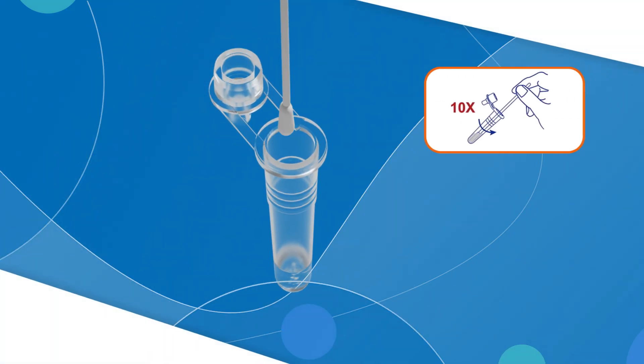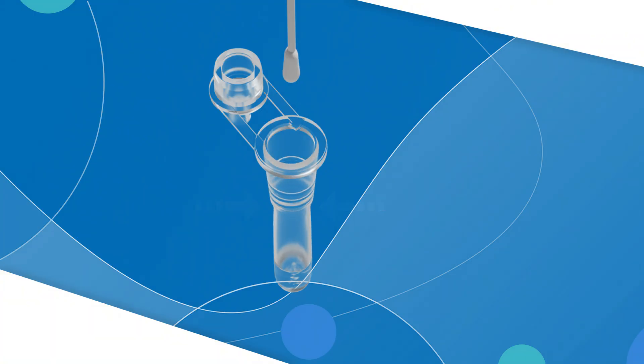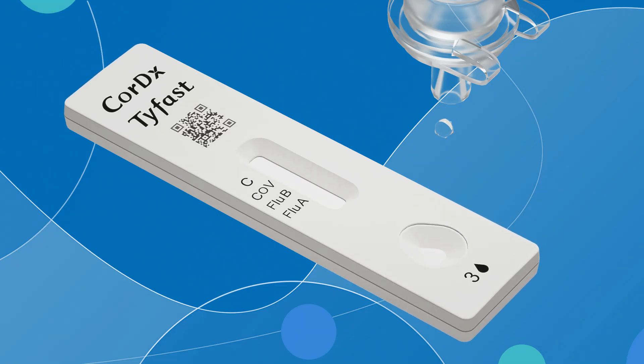Place the swab into the tube. Rotate the swab at least 10 times while pressing the swab head against the bottom and sides of the tube. Remove the swab while squeezing the sides of the tube, then close the cap. Slowly squeeze the tube and dispense three drops of solution into the sample well. Invalid results can occur if less than three drops are added to the sample well.